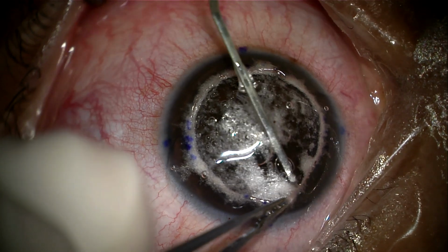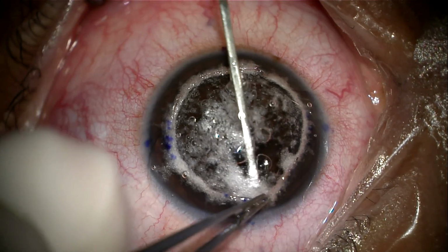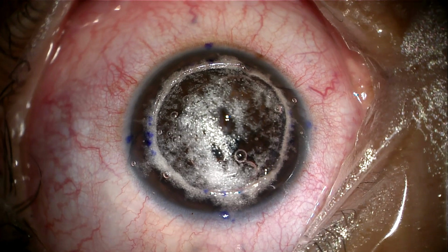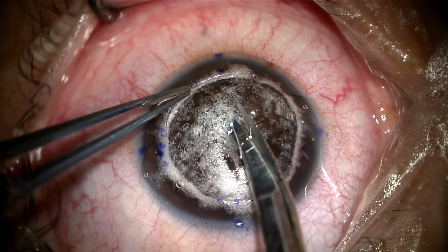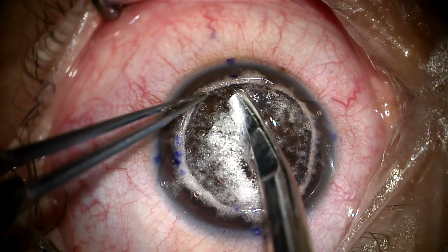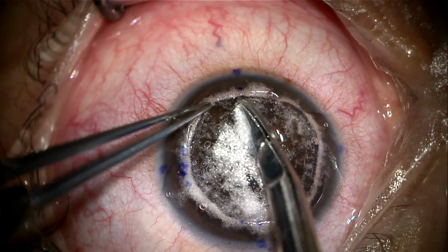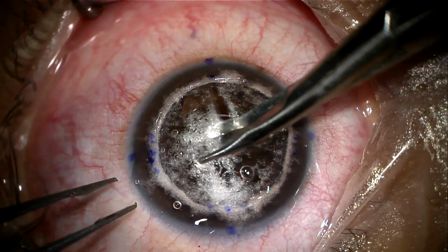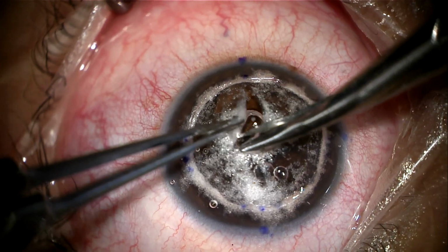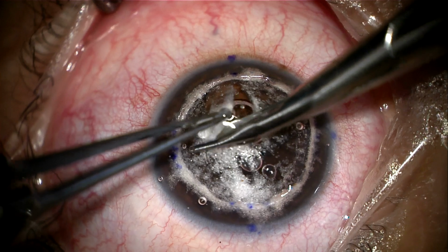Before dividing the stroma, a blunt spatula or dissector is introduced in the plane between the predescemetic layer and the stroma to ensure proper dissection till the trephination groove. This step is very important to avoid perforation during cutting the stroma. The spatula should be introduced towards the stromal surface and not on the predescemetic layer to avoid Descemet membrane perforation.